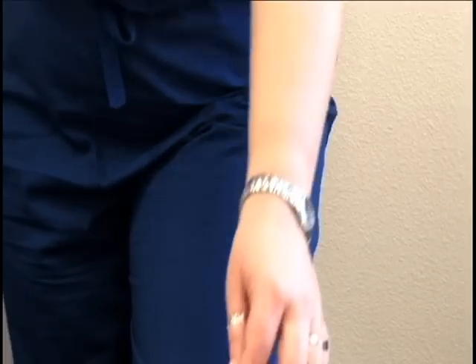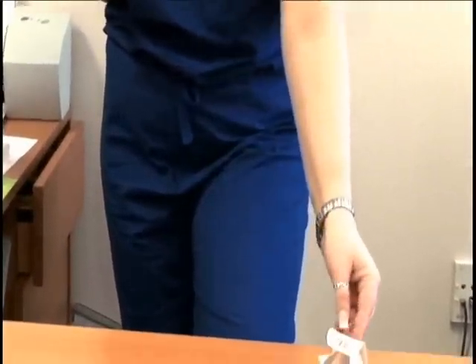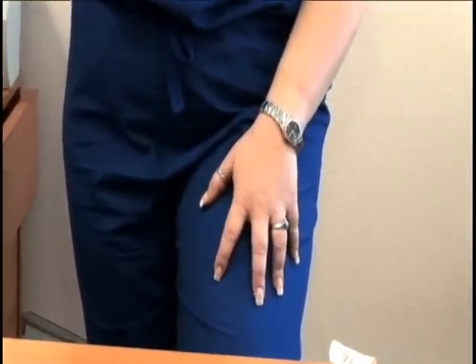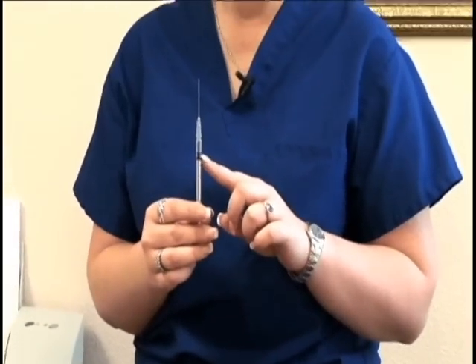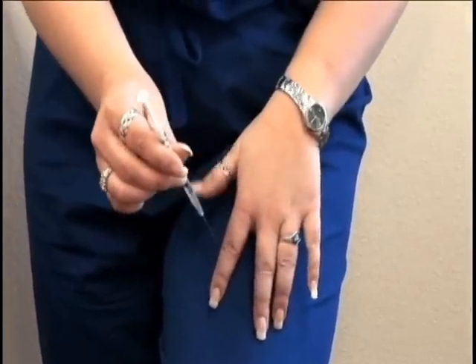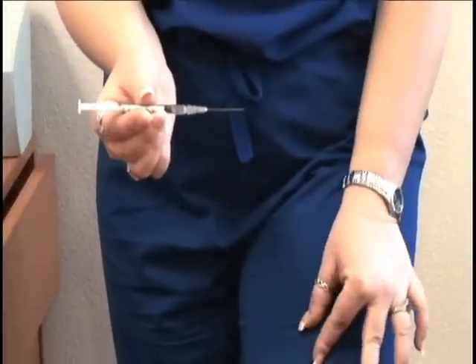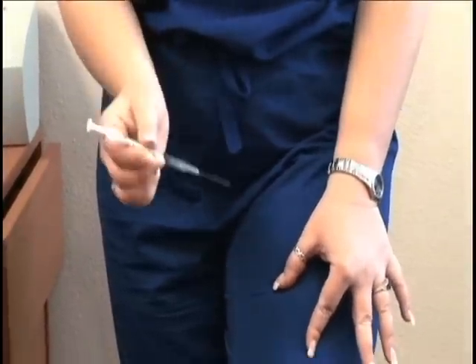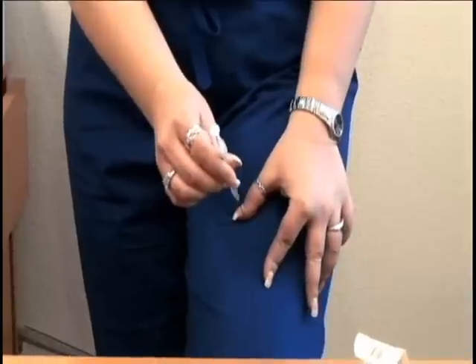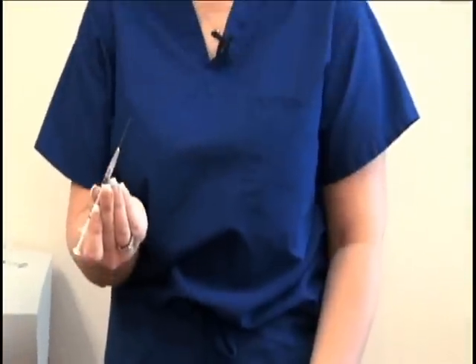Take the alcohol swab, clean the area of the skin, and allow it to dry. Then remove the cap from the needle and inject the medication straight in. With a sub-Q injection you typically pinch up the area, but with an intramuscular injection you want to spread the skin with your fingers. Inject it all the way in, push the plunger to dispense the medication, pull it out, and dispose of the used syringe into the sharps container.